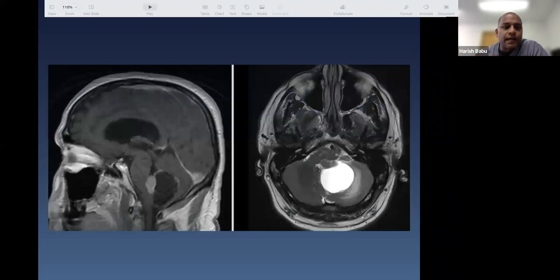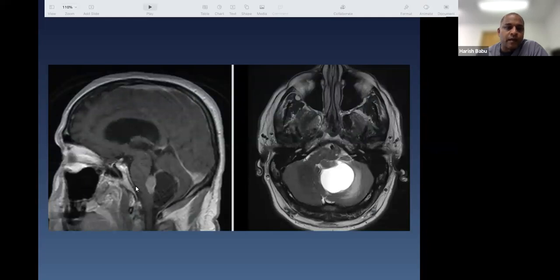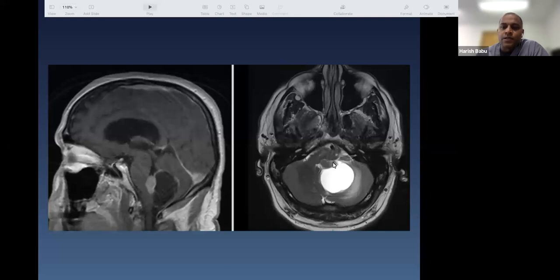This is what the MRI looks like — you have an enhancing nodule with a big cyst, almost compressing the foramen magnum, with significant brainstem compression and some degree of ventriculomegaly. On T2 again: a nodule with a CSF-density cyst.